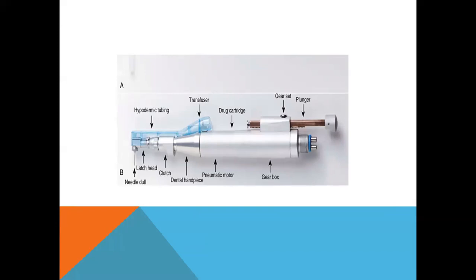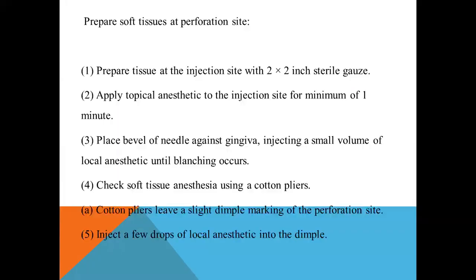Sometimes you might get a picture-based question, stating what this picture indicates. This picture indicates the Intraflow delivery system. So this is a part, just remember the parts. So this is a procedure.